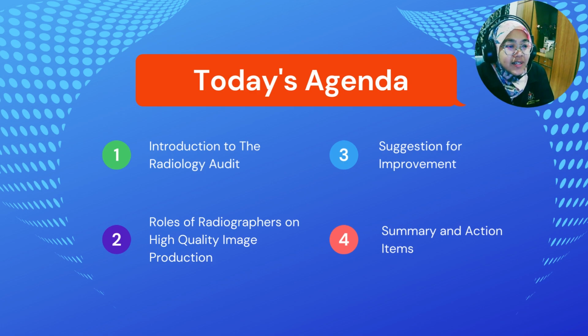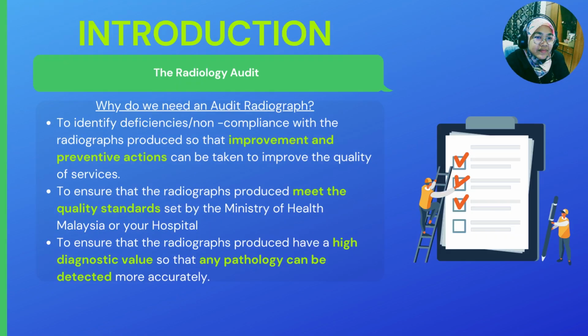Today's agenda, I will cover start from introduction to radiology audit, and then the roles of radiographers on high quality image production. Thirdly, suggestion for improvement, and lastly, the summary and action items. As I mentioned earlier, I will start with the introduction of the radiology audit. So, why do we need an audit radiograph?